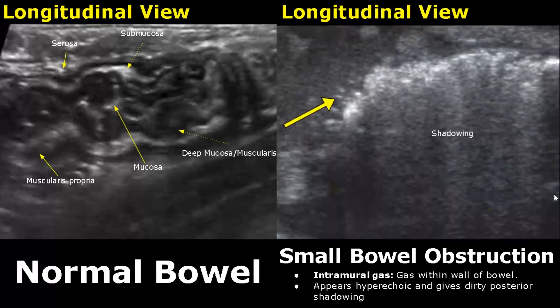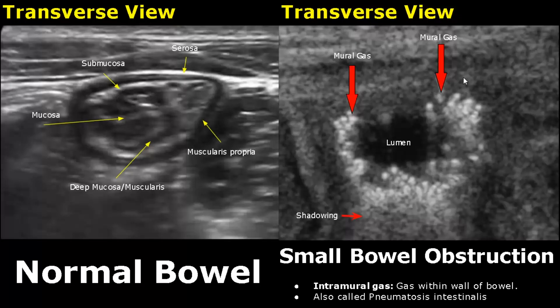Intramural gas is another feature of obstruction. Gas is found within the bowel wall — it will appear hyperechoic and has dirty posterior shadowing. Gray shadowing is seen posterior to the gas. Here is a transverse view of intramural gas; you can see it much better in this view. Gas is found within the walls, and here is the bowel lumen.